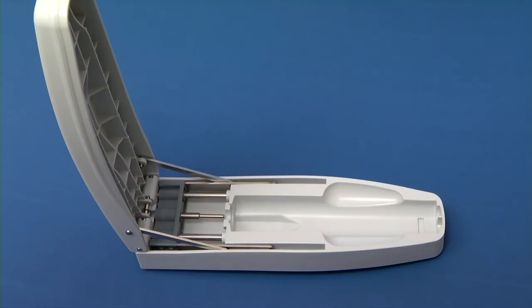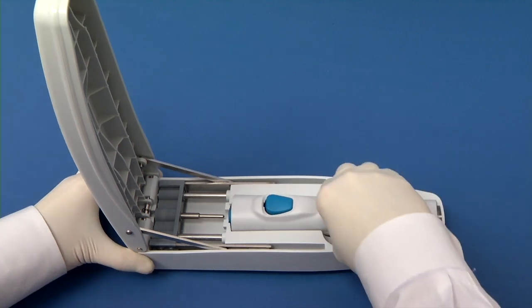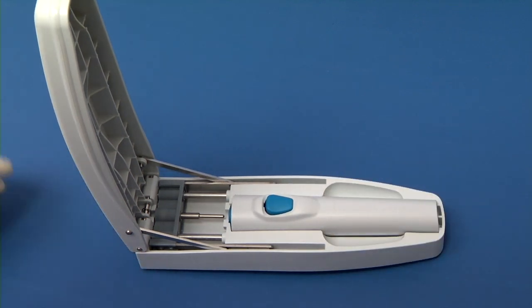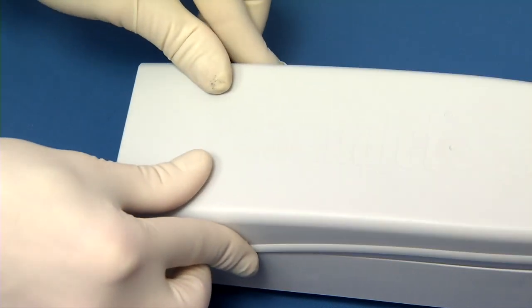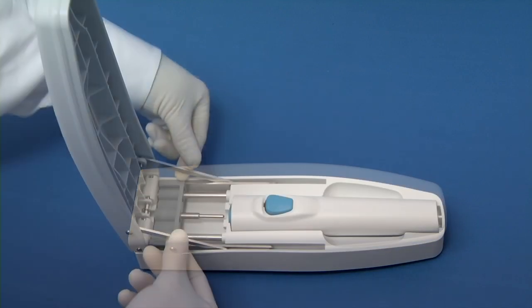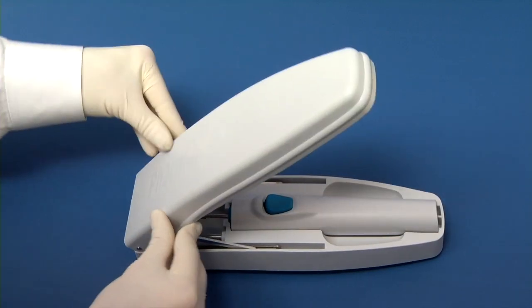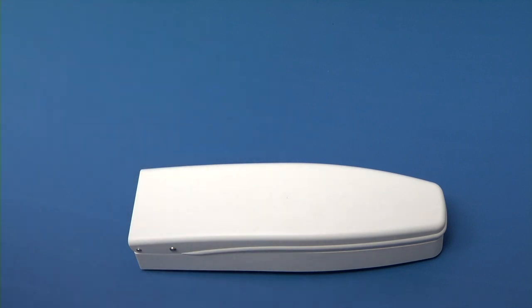When the injector is not in use, the reset station can serve as a storage device. With the lid open and at a full 90-degree angle from the base of the reset station, insert the injector nose first into the recessed area. Lightly pinch and lift up the two metal arms on the reset station, and maintaining that upward pressure on the arms, gently close the lid. If you feel resistance, start again. The lid in this resting state should fully close without charging the injector.